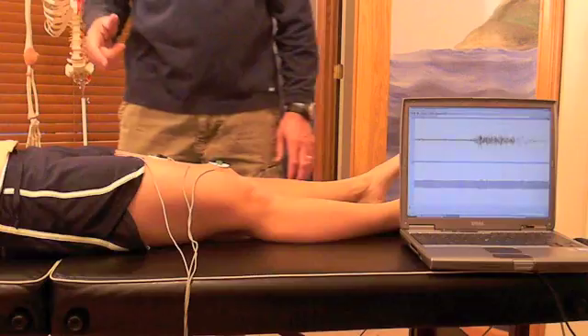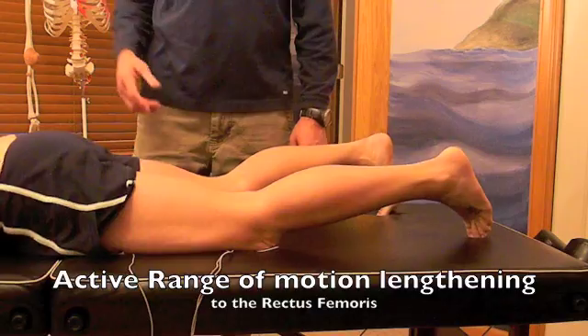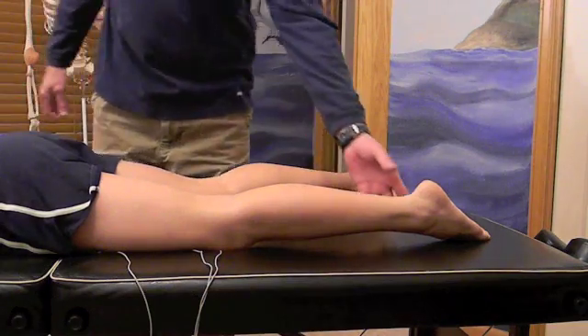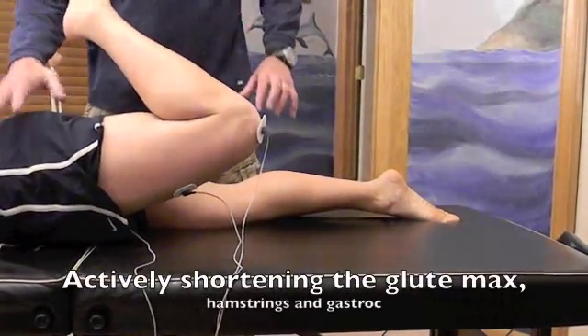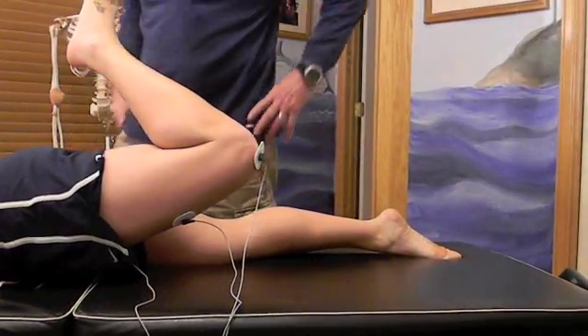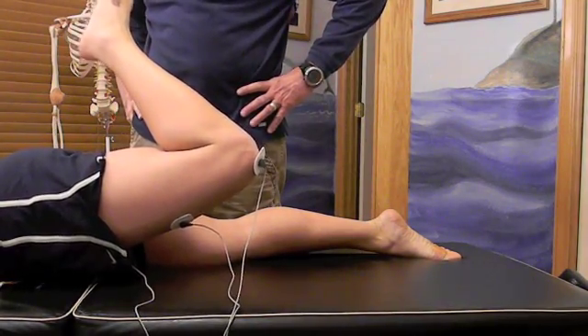Dana, I want you to flip over — Dana's going to do an active range stretch. What that means is I'm not going to apply any force and Dana's not applying any force. She's going to bend her knee as far as she can and lift her leg as high as she can, tightening the glute and the hamstring, which will stretch the rectus femoris. Hold there — one, two, three, four, five, six.